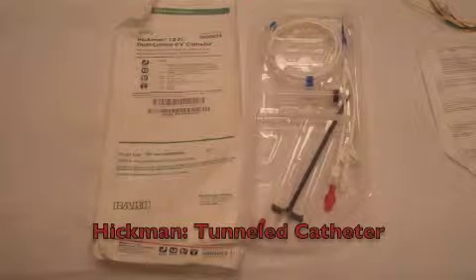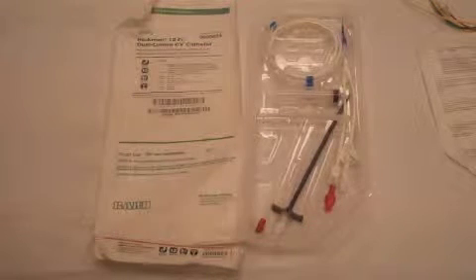This picture is an example of a tunneled cath. There are a few brands out there, but the most common one is the Hickman. These are used if long-term therapy is needed, either continuously or occasionally.